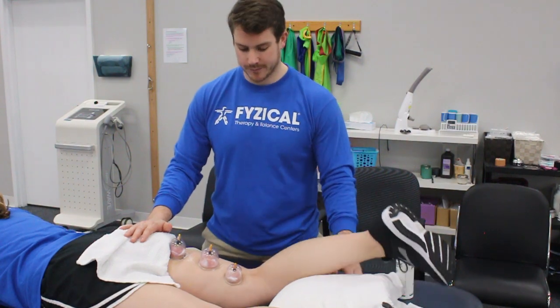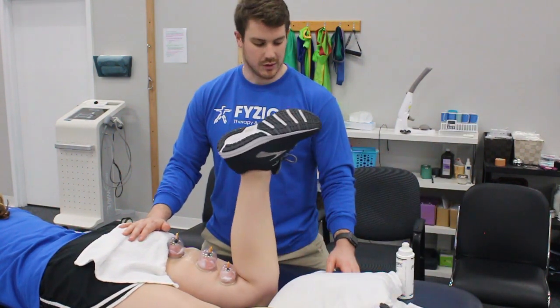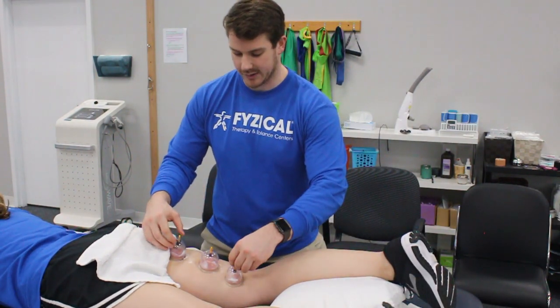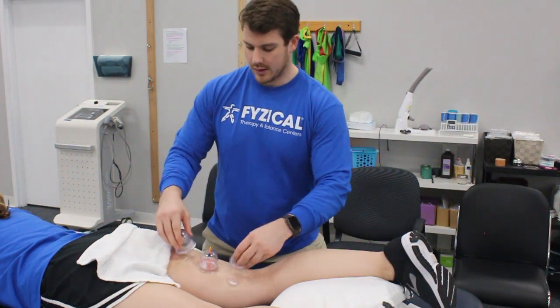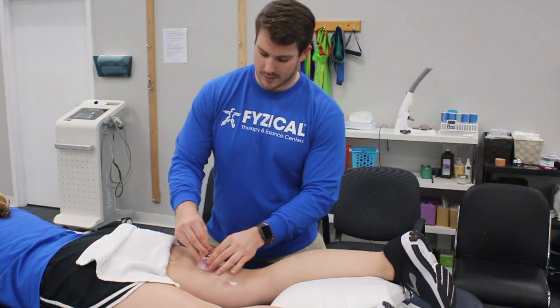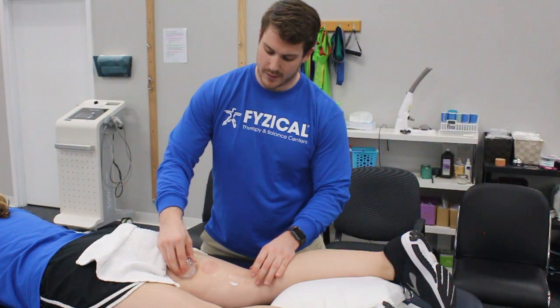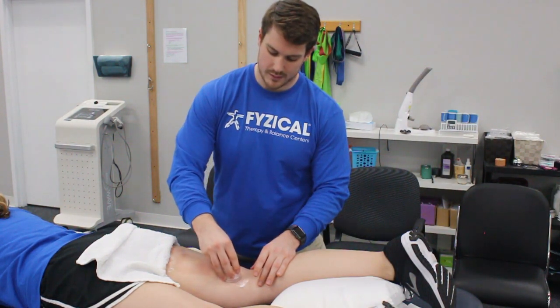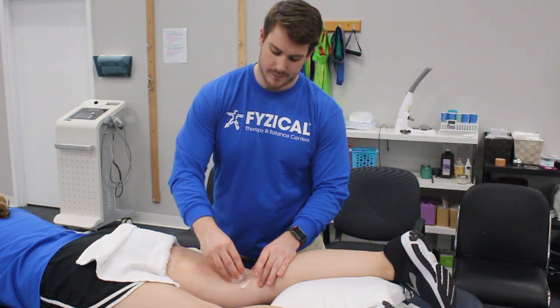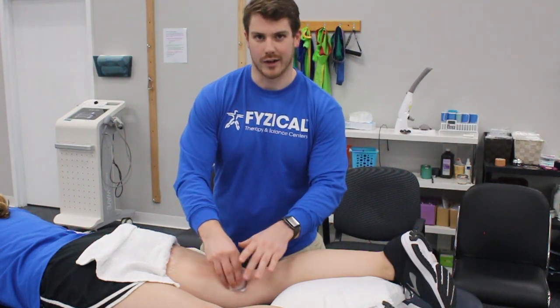Then I can have her do it on her own. After we put that on, usually about 60 to 90 seconds, I can drop down to one cup and do more of a massage — just moving the cup up and down on the skin, loosening that entire area up.